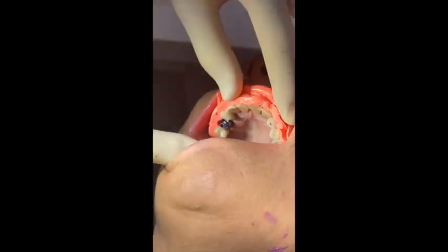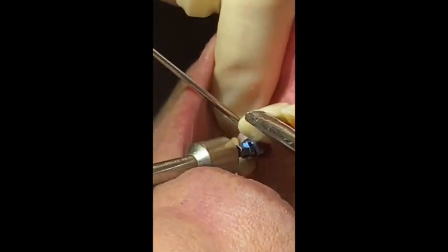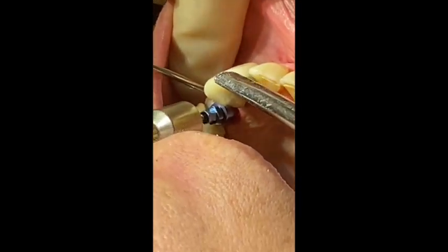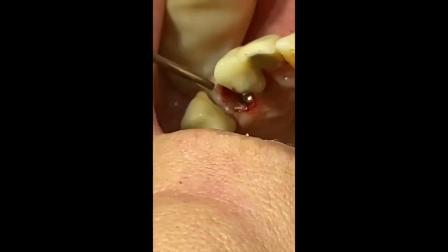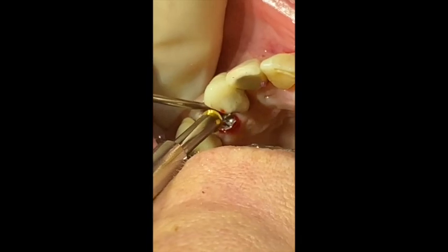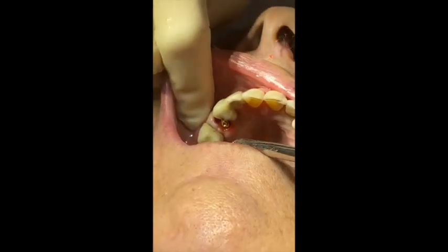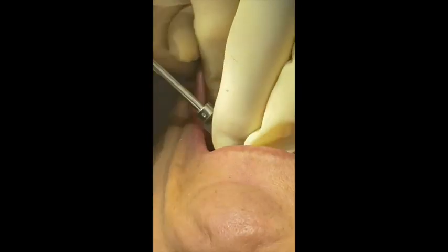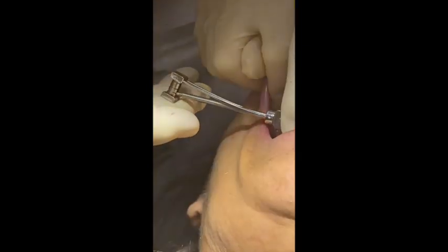Perfect position based on the key. We've removed the fixture mount and we go one abutment, one time — here we go. Bravo. Let's see your torque: top formula about 45 Newton centimeter.